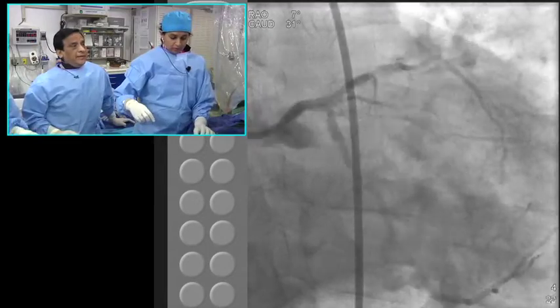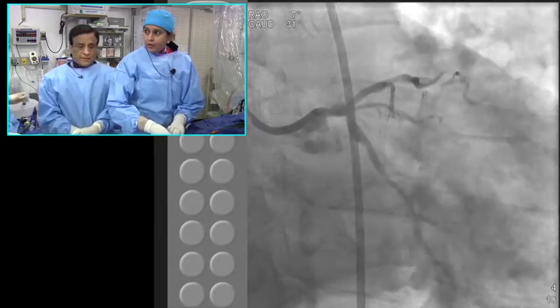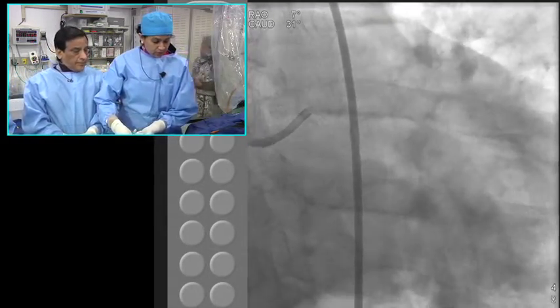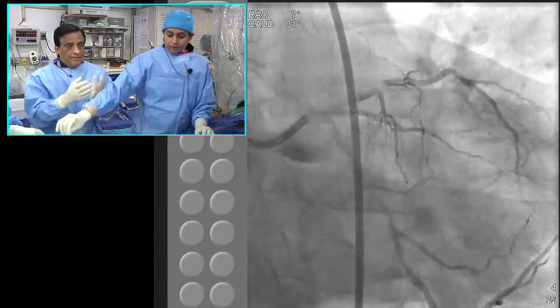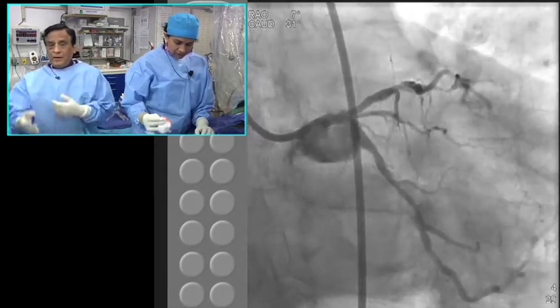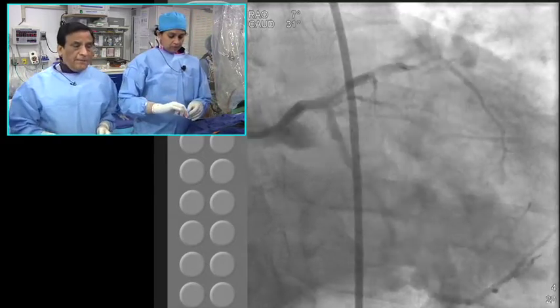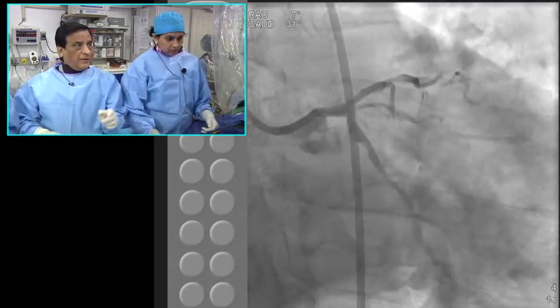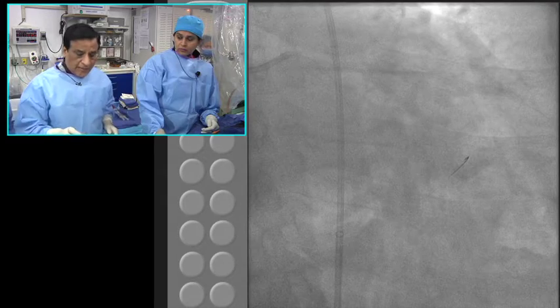Yeah, actually in about 1,000 plus cases of intermediate lesions like this, one of our fellows is working on coming up with a predictor of what really made the difference: the vessel size, the lesion length, or an associated patient MI, and so forth. So we really come back to that point, with deep analysis taking place. So clearly we are going to put a stent, and then we'll come to the LAD and do a live FFR. We go back to our slide.